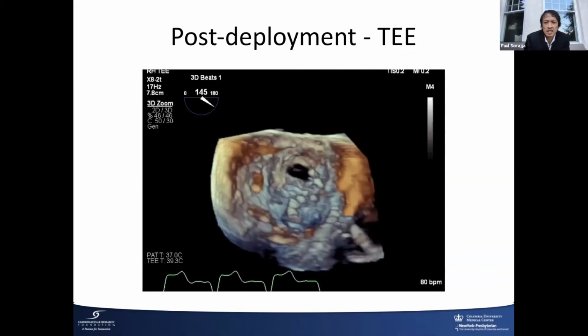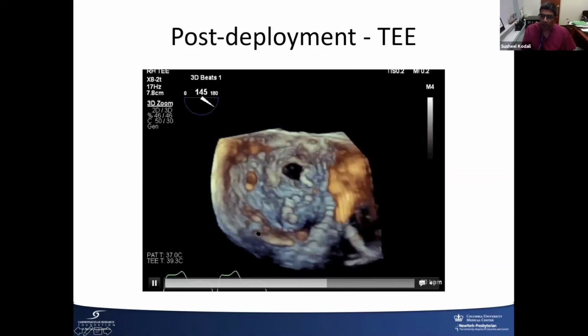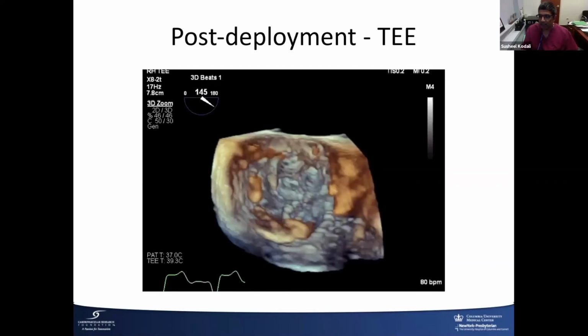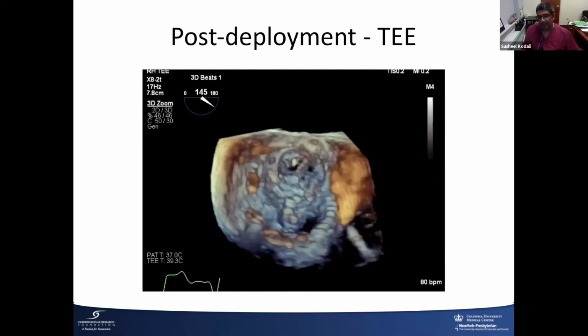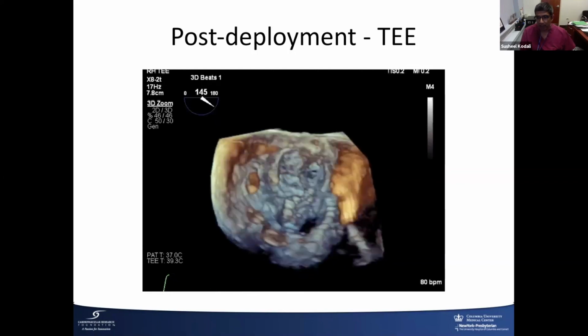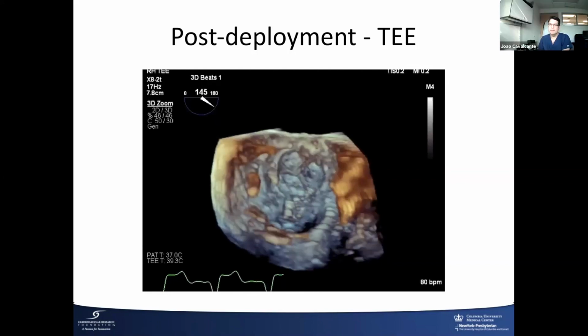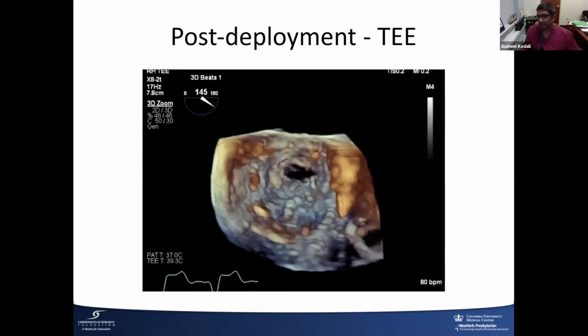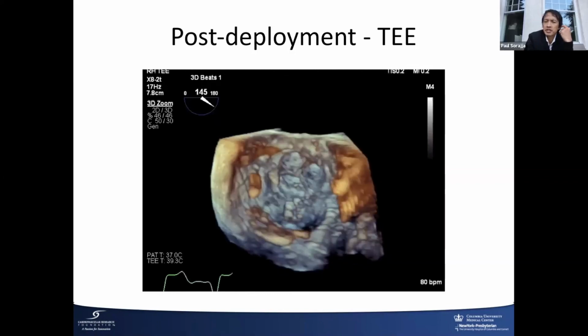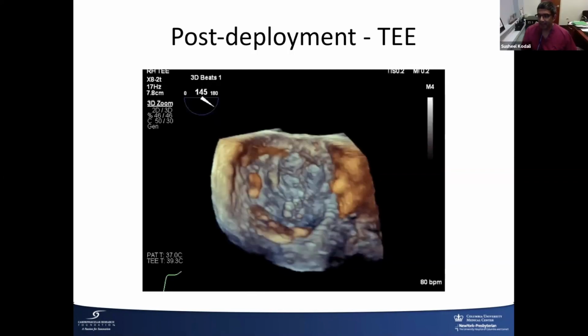Sushil? Yeah, I agree the same. As long as you can do oversizing, I feel comfortable. But we've had a case where we've had to put a Sapien inside, right? It dove deep and we had to pull it up, and it's not going to stay, so we used that basically as an expensive stent to hold the Sapien. When you put the Sapien inside, you have a snare holding the Evolut while you do it? Yes. Yeah.